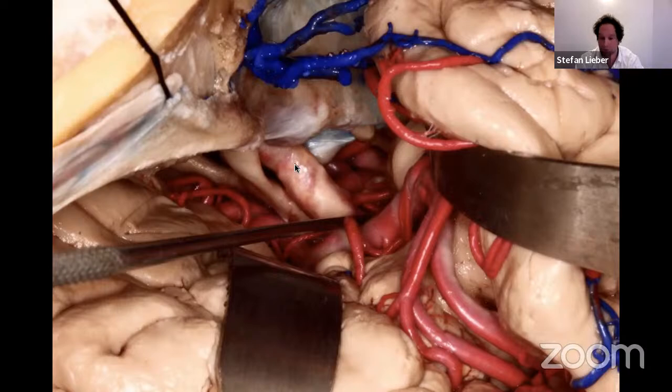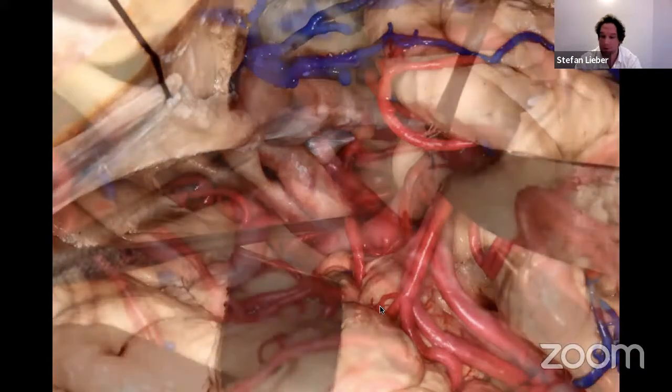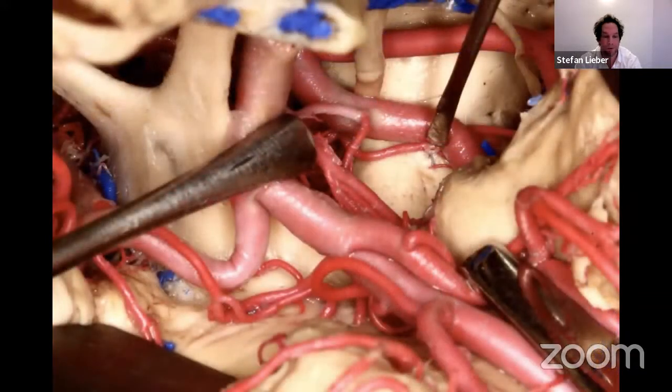All this can be exposed with this Sylvian split for vascular neurology, oncological surgery, access to the cistern, suprasellar space, and all this. This is just another example a bit further down, mobilization of SCA and PCA, third nerve, chiasm here, and anterior and middle circulation. This is the deep anatomy that can obviously be reached.